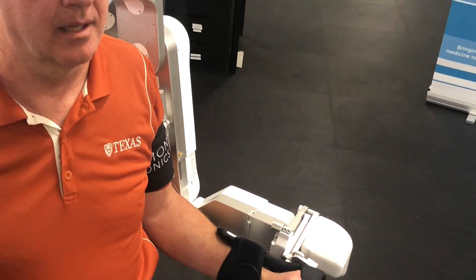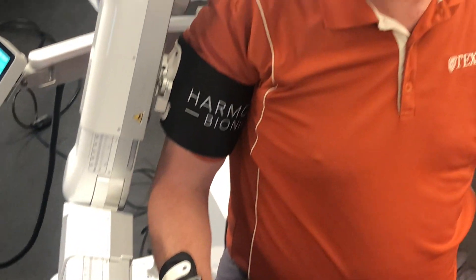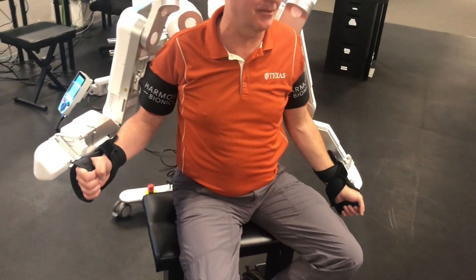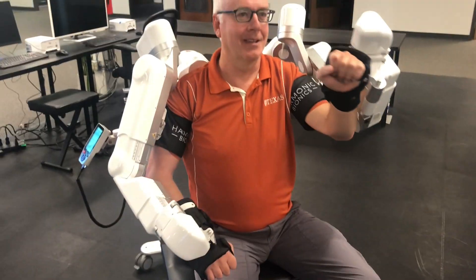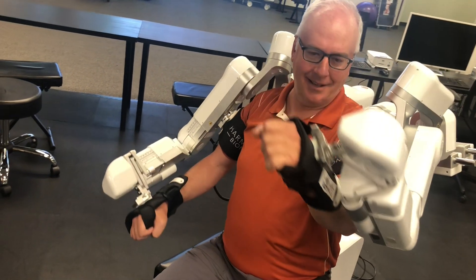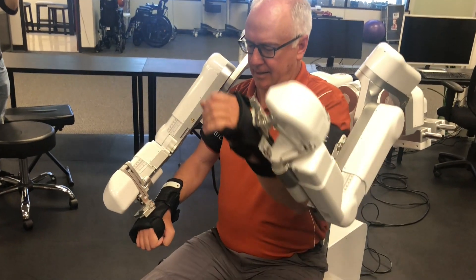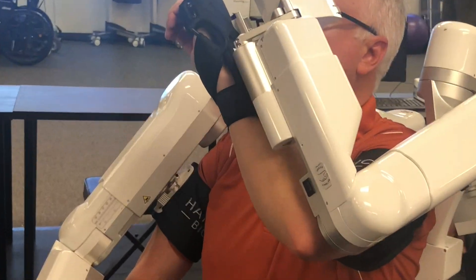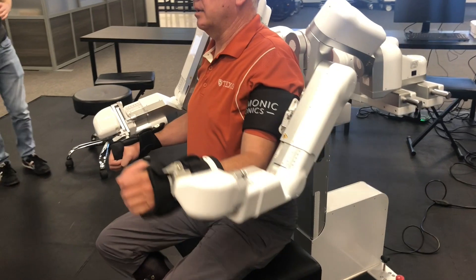Crossover — oh, you want to do two and three? It's Night Fever. You got the disco. There are two therapy patterns, which they call P and F. One of them is this movement, and the other is your disco. So we just put your two arms, one on each. So many stroke patients get frozen shoulder because they're just lying in bed not doing anything — not moving. There are two John Travolta references out of the six: one is Greased Lightning, and one is Saturday Night Fever.